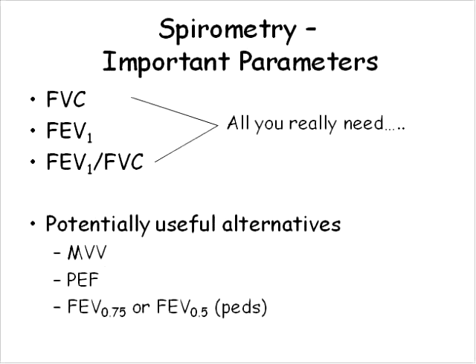So I'd like to start with talking briefly about spirometry and what we need to do to simplify spirometry. And again, I think in terms of all we really need are the things that you see listed here.